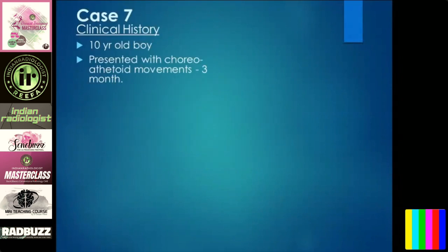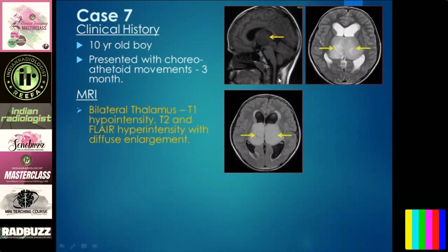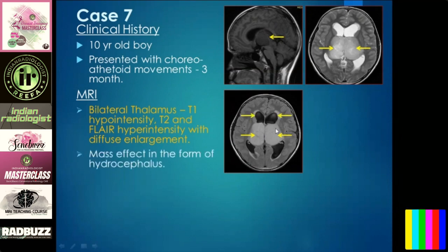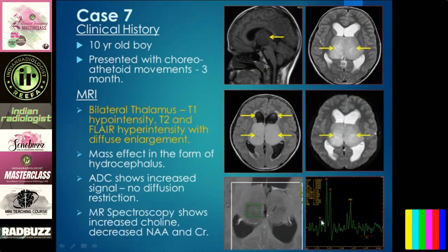Case seven: a 10-year-old boy with choreoathetoid movements for three months. MR imaging shows bilateral thalami that are T1 hypointense and T2 and FLAIR hyperintense, but with diffuse enlargement. Diffuse enlargement with T2 hyperintensity should always raise suspicion for malignancy. Unlike infarct or thrombosis, here you see mass effect causing hydrocephalus. ADC shows increased signal — no diffusion restriction.